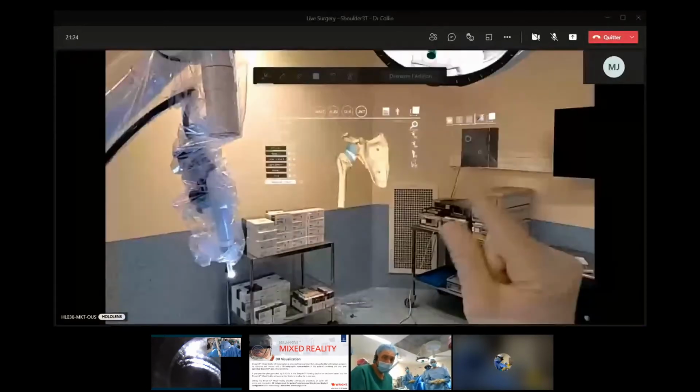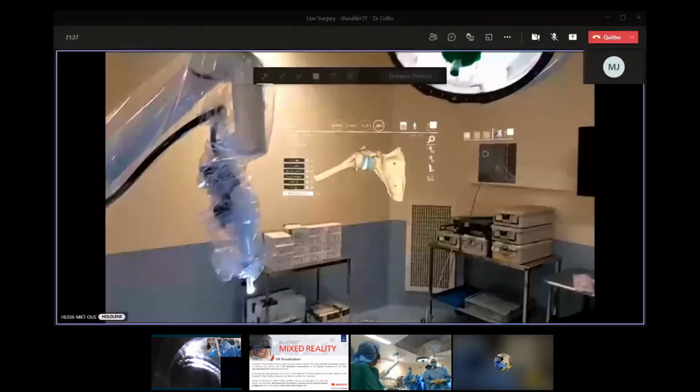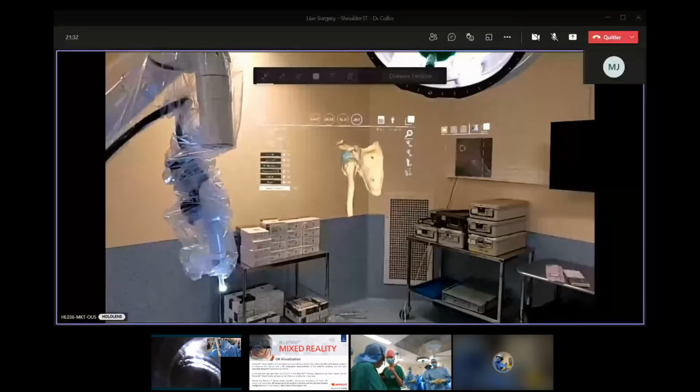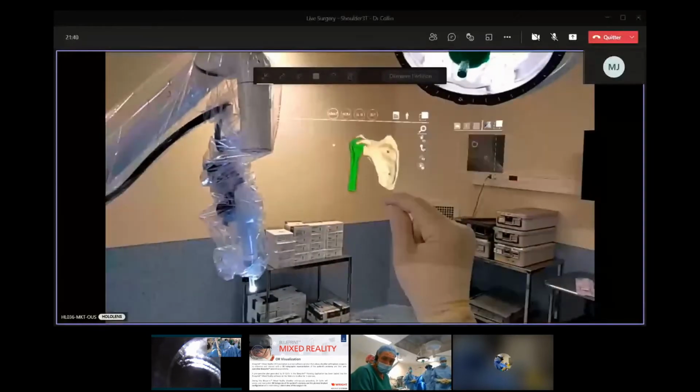You see that I will see, this is the goal. This is what I want to have at the end. So let's turn to the anatomy. Is there any question? I can show something, or we can start to go directly on the patient now.